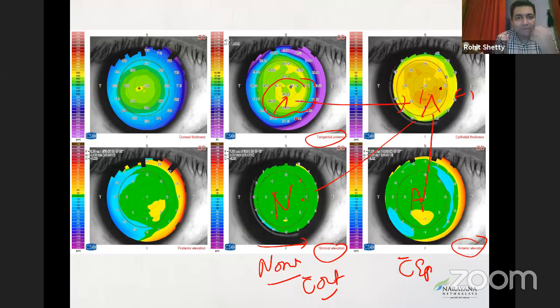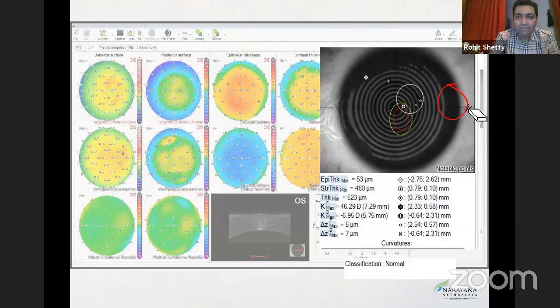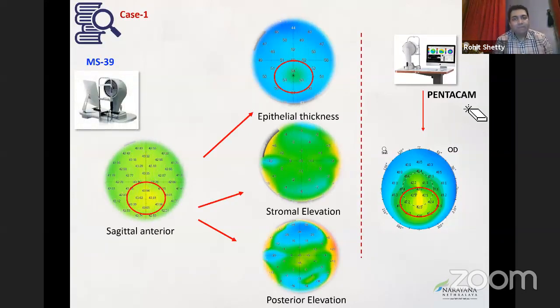So this is very important because many times in your new normal, we are always suspicious. If you can't match two machines' imaging, it becomes very suspicious about what's happening. And this is what I explained. And I also explained about this whole map, how these indices can really help you in understanding the new parameters. So let's look at some cases.